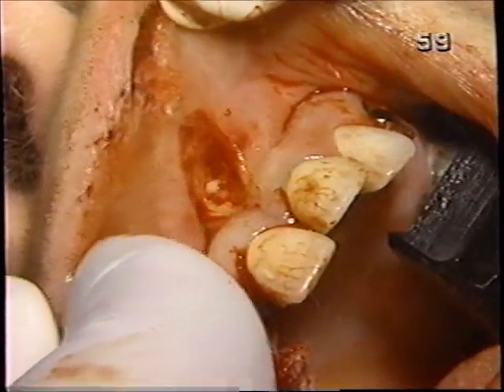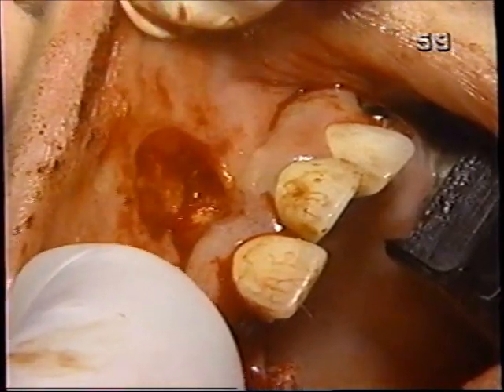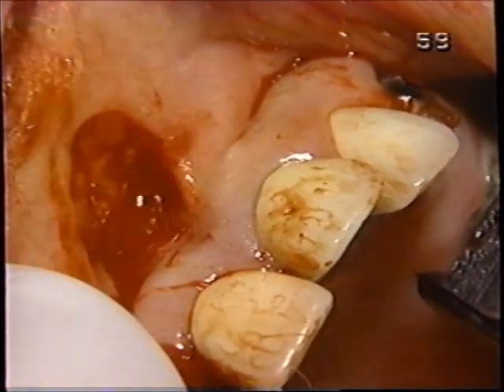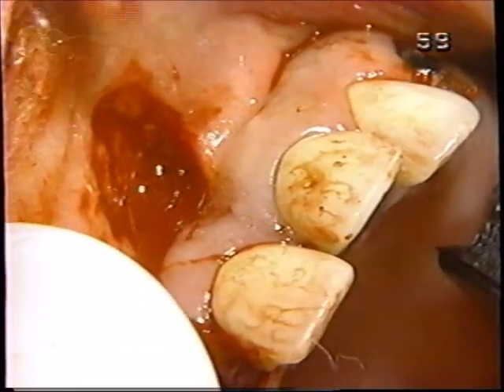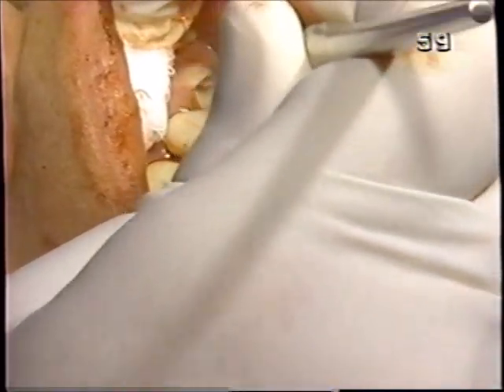Let's just take a look at that now. So an incision on the one side and on the other, and then against the ridge, just up against the periosteum, and then excising the whole thing, joining the 2 V-shaped incisions. Let's go this far.